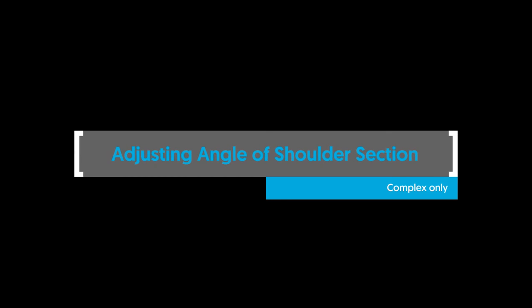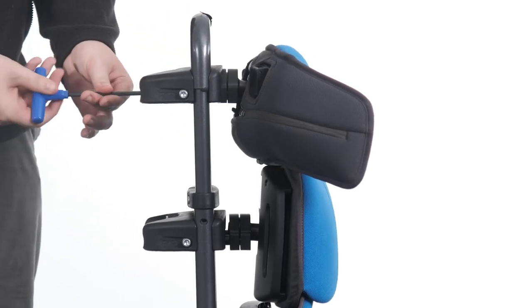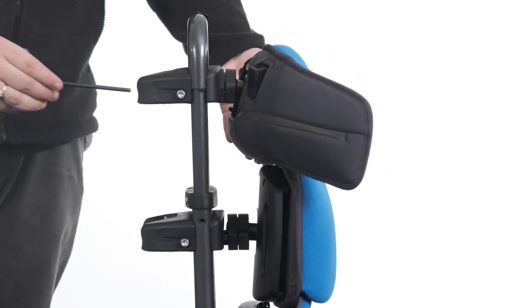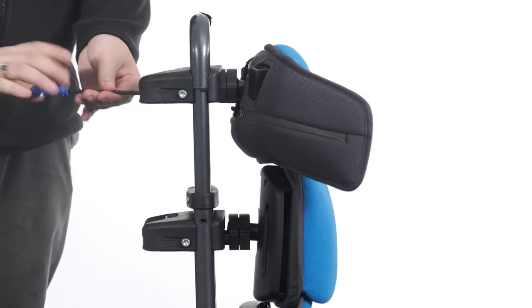Adjusting angle of shoulder section — complex only. To adjust the angle of the complex clamp, loosen the bolts of the clamp. Adjust the angle by rotating the backrest section in all axes to the desired position. Tighten the bolts to secure in position.